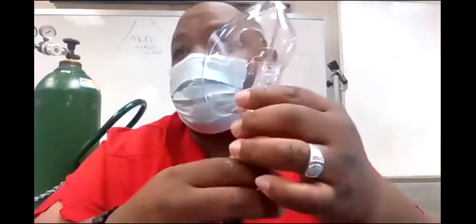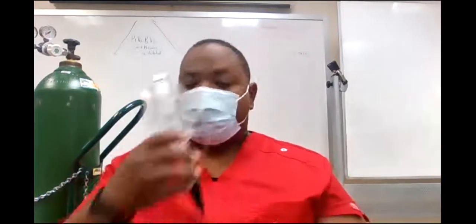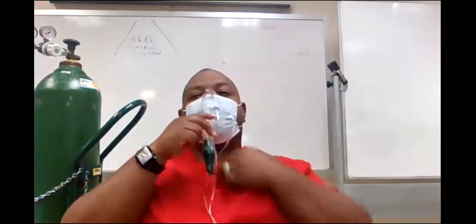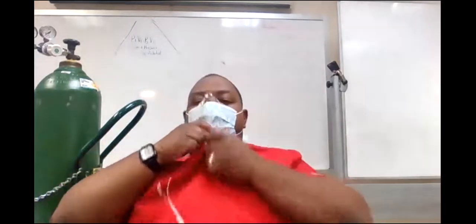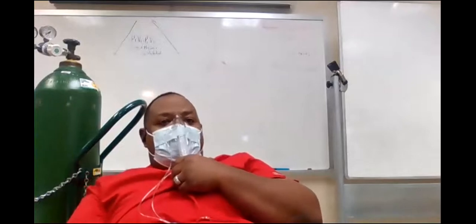Now, what if I have a COPD patient on a Venturi mask at 28%, okay? He's getting 28%, he's a COPDer, right? So I want to be careful on the amount of oxygen I give this patient, right? I want to make sure he's not getting too much, right? Well, what if Mr. Johnson is in the bed with his Venturi mask and you come in the room and the Venturi mask is under the bed sheets and he's watching the game? How much oxygen is he getting?